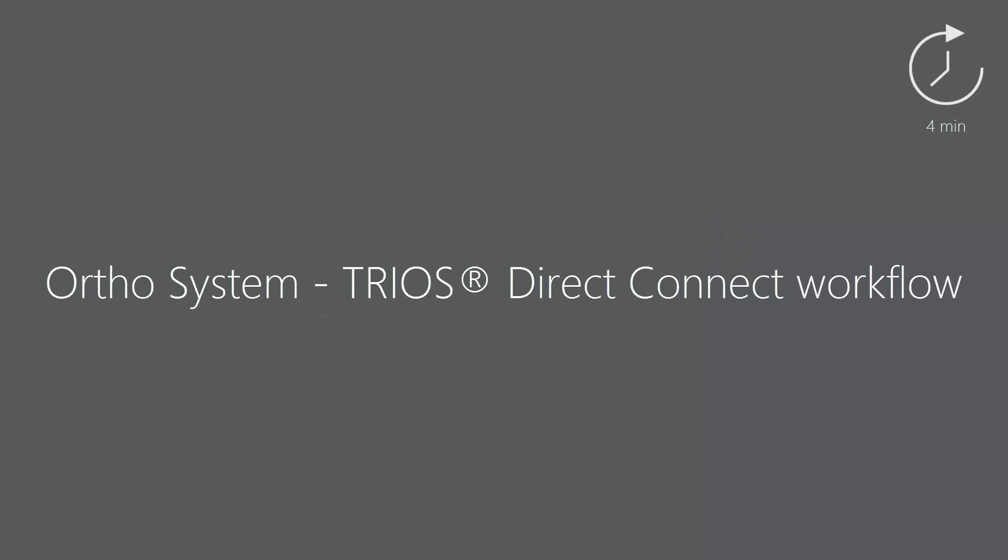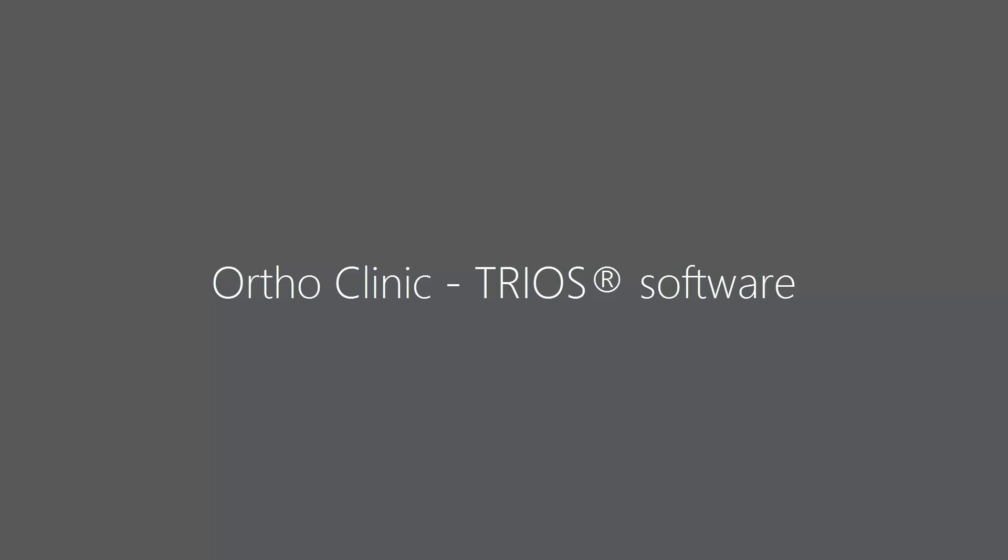In this video you will learn how communication works via Direct Connect in the TRIOS and Ortho system. First, you will learn the OrthoClinic part of the integration workflow from TRIOS Direct Connect.